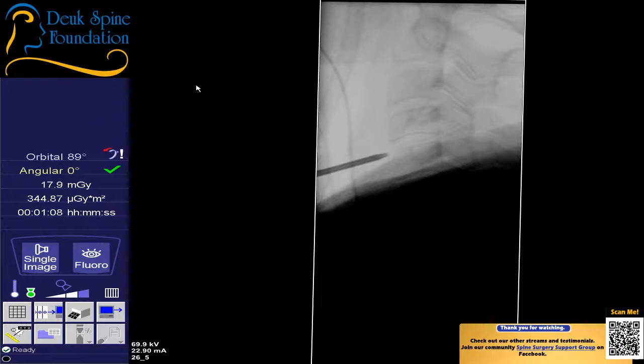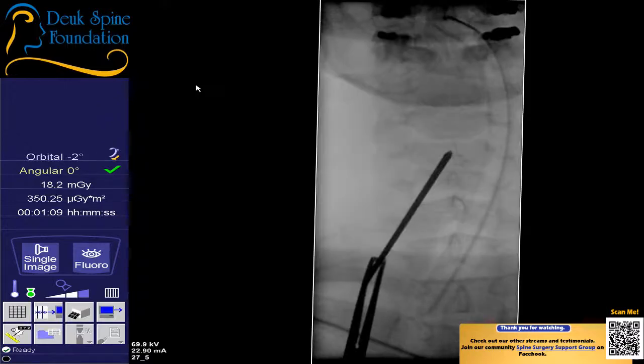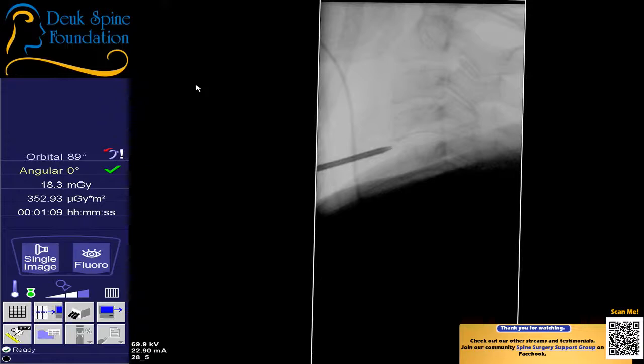I need to be a little bit higher. Shot. That's perfect. Let's go AP one more time. Remember I told you, never go into the disc until you verify on an AP that you're in the middle. That's perfect. Lateral. And by the way, I'm pushing down with the tip, locking it on the ALL, anterior longitudinal ligament. I don't want it moving. All right. I love it. It's perfect. Now I'm going to go in and give it a little kiss. Shot. Oh, yeah.